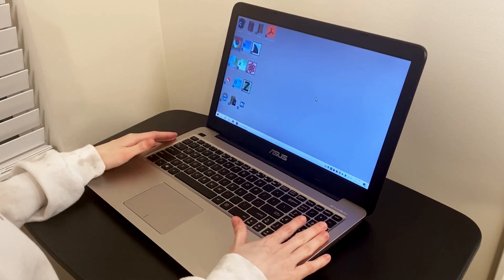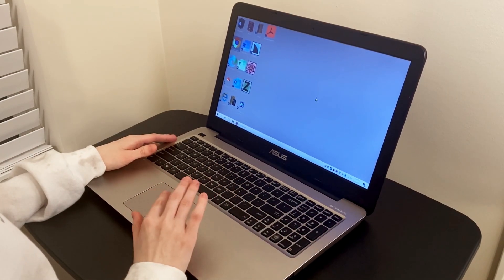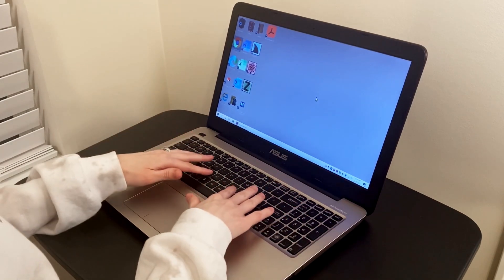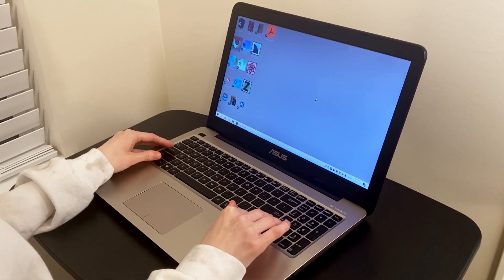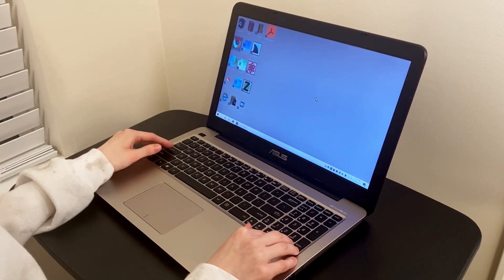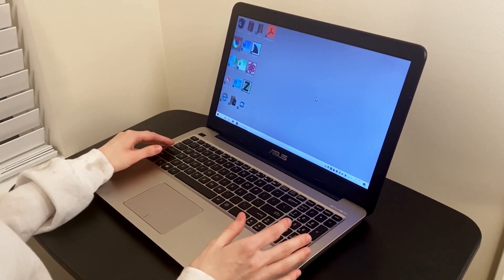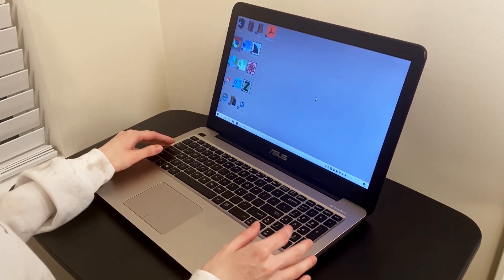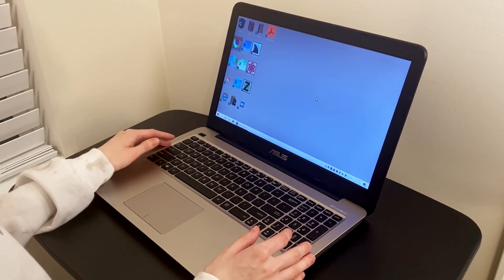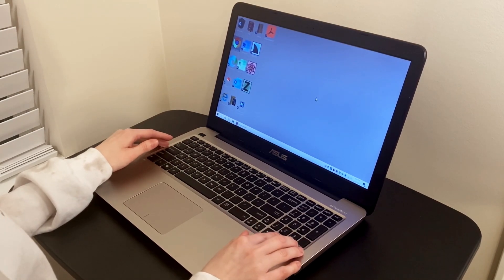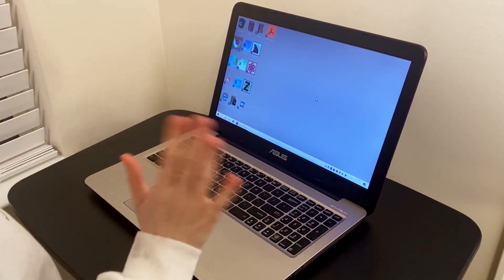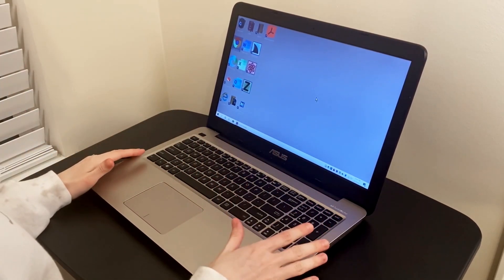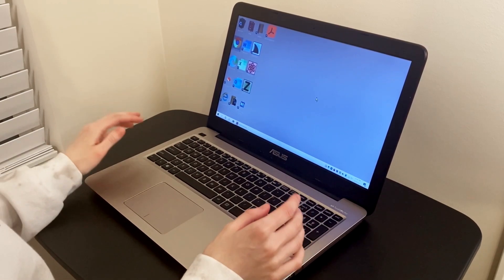I don't use a mouse at all because I can't see it, so everything I do I just use the keyboard. There are keyboard commands that are specific to JAWS, and then there are a bunch that are just Windows key commands that anyone — even sighted people — can use without a screen reader. You may be familiar with Ctrl+C to copy and Ctrl+V to paste. There are actually tons and tons of keyboard commands, but like I said, I'm just going to go over the basics.